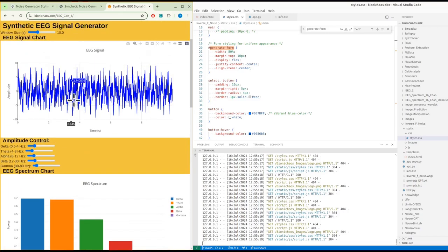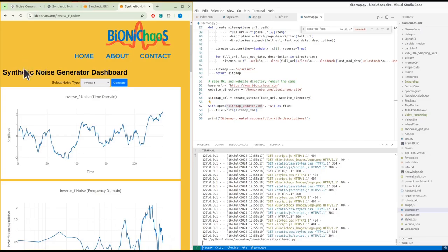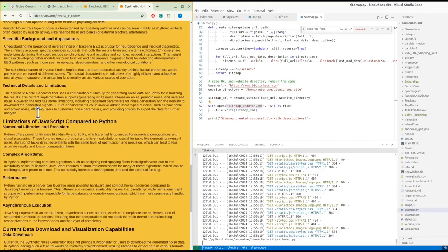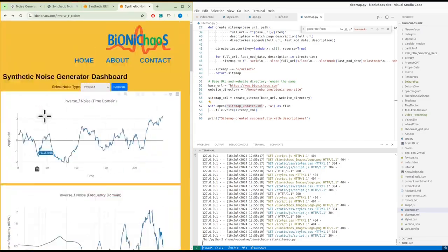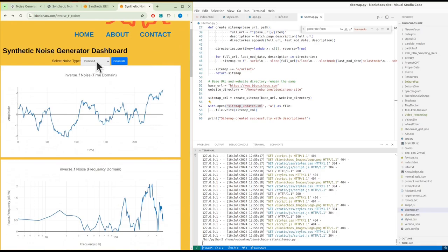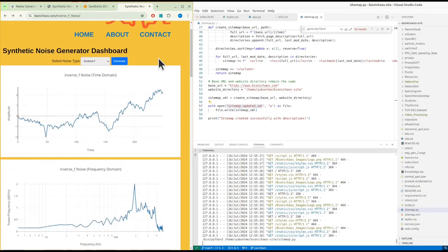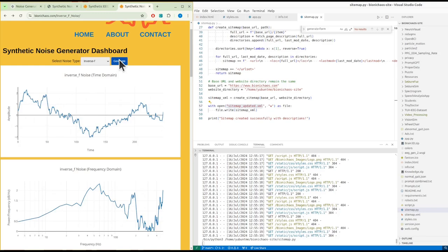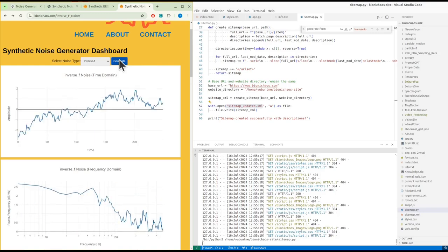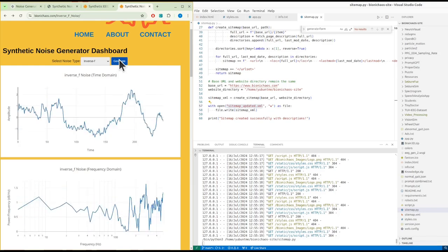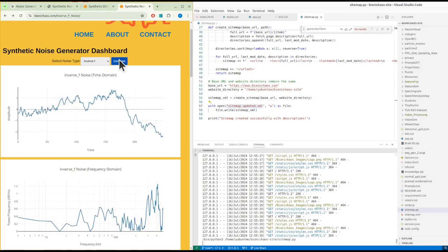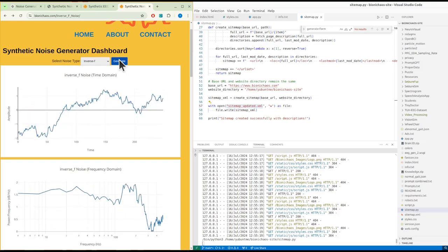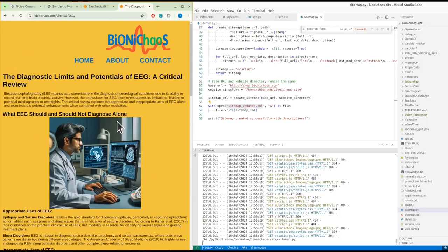There's not much to EEG - it's essentially amplitude and frequency. Yes, there are interactions between channels and so on and so forth, but we'll start with one channel. And yes, this tool is also already available right now. The inverse f should be the default.